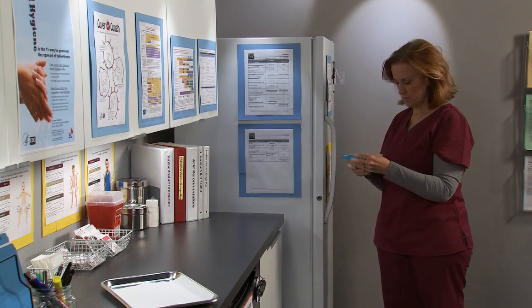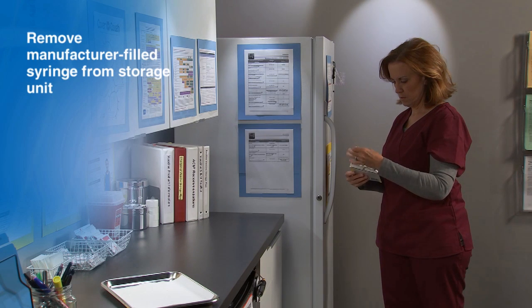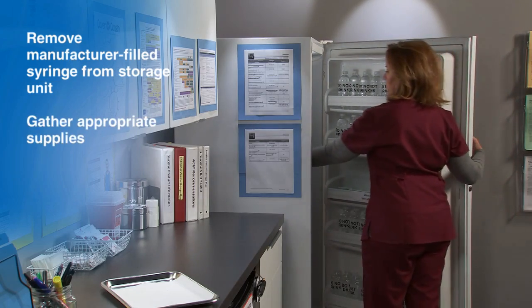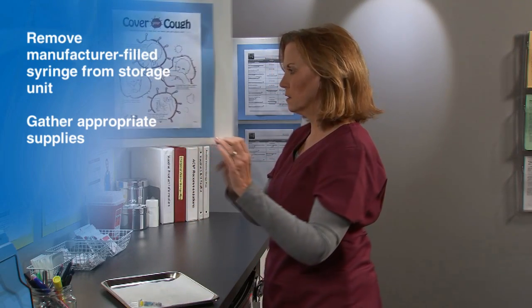Begin by removing the manufacturer-filled syringe from the storage unit. Then gather the appropriate supplies, including the correct needle length and gauge if it is not supplied by the manufacturer.